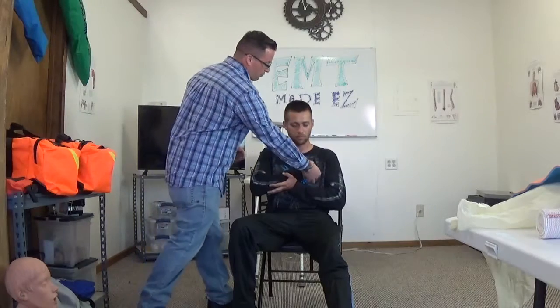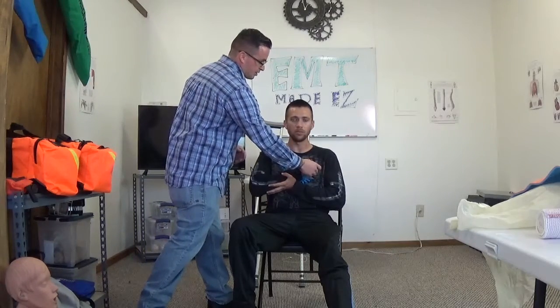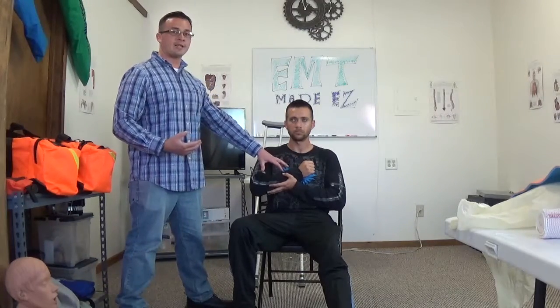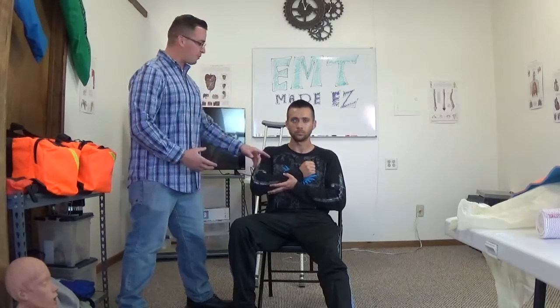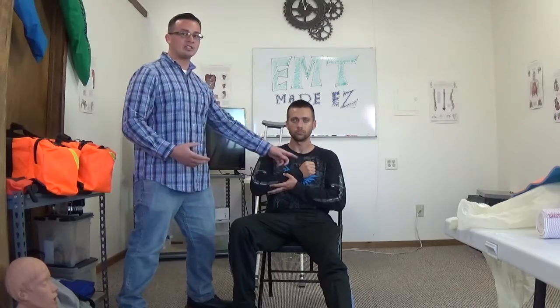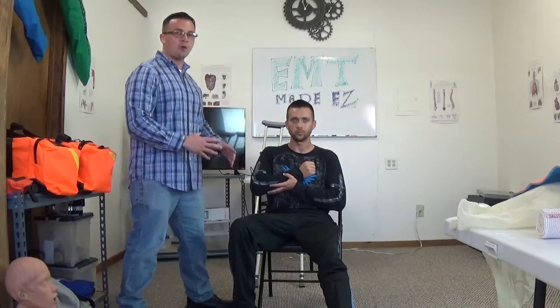The reason you're checking for CMS is that you might have to realign or adjust the limb. If there is no circulation going to that hand, you need to know. You're checking for circulation to make sure everything's good to go, and whether it might have to be adjusted.